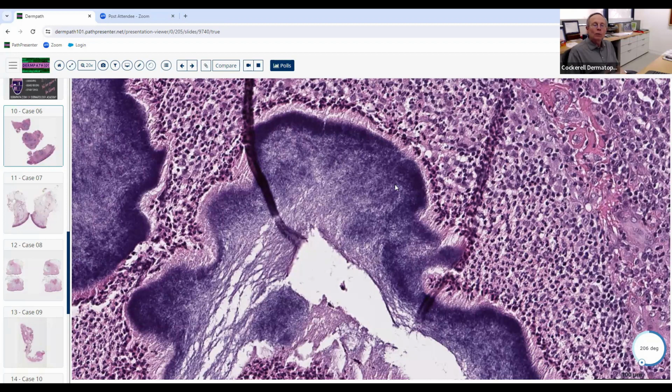There are several different colors of those, and I would recommend boning up on them. But you'll see the hyphal elements, and especially if it's one of these maduromycosis lesions with a brown grain, you'll see the dematiaceous fungal organism. It's almost like lots of copper pennies clustered together. You'll see that in the grain itself. So you should be able to tell the difference between an Actinomyces grain and one of those grains.